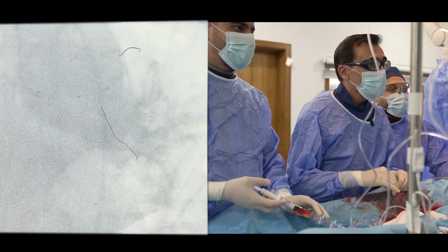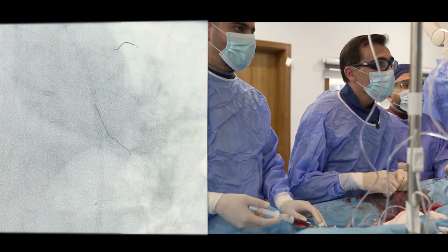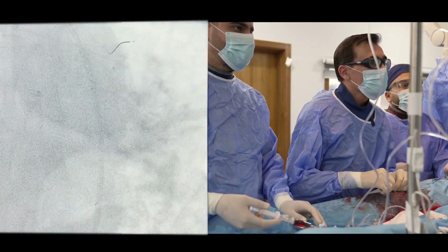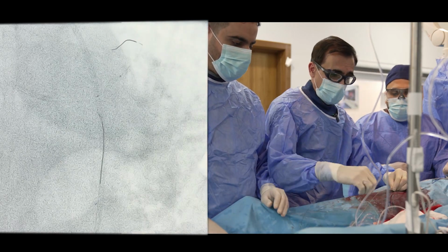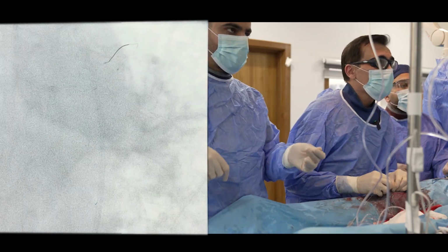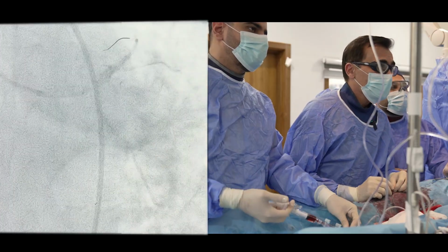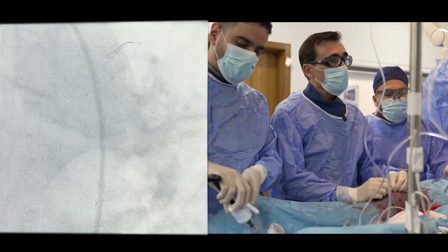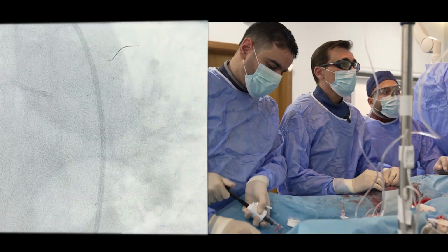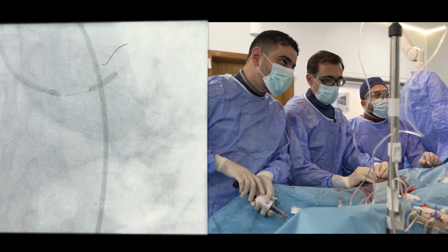Okay, we passed, but now we have to take out the circ wire. I think it's damaged. It has been intermingled by the other wire. Tiny test. Give me test, okay? Okay, go. Nominal 6. Okay. 6. Off.